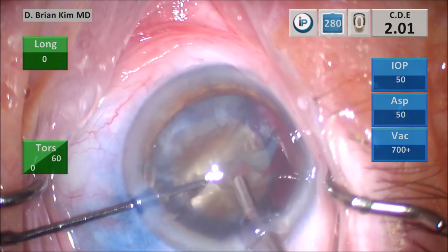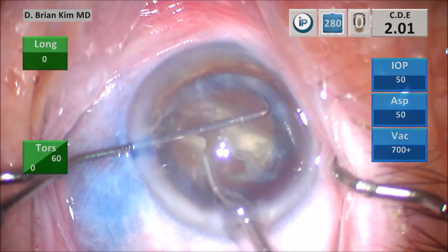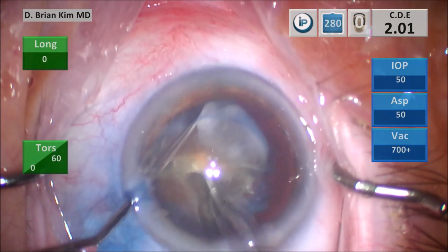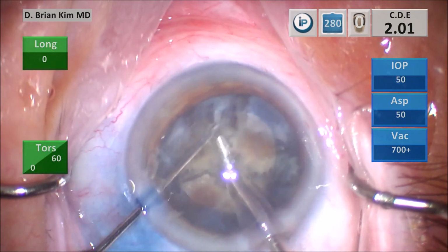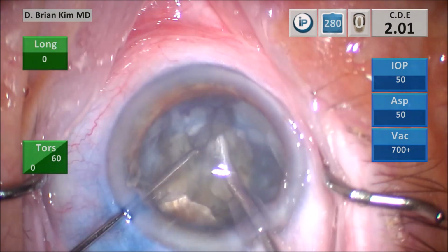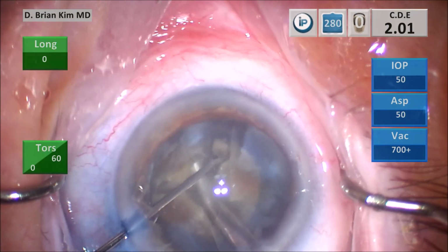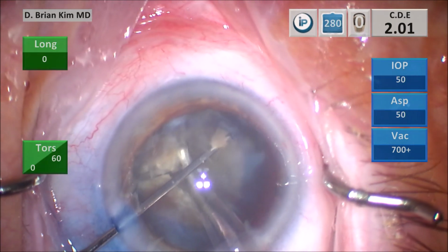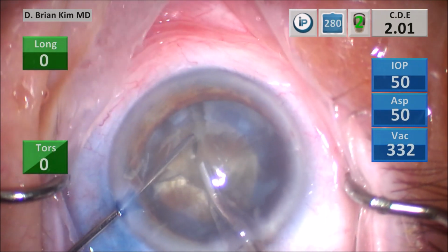I'm turning the lens very carefully, going after that second heminucleus, placing the chopper around the lens piece, placing the phaco tip deep, crushing it and dividing that lens, and then just cracking and cracking. There are some, again, posterior adhesions here as well. Taking my time and cracking it and cracking it.